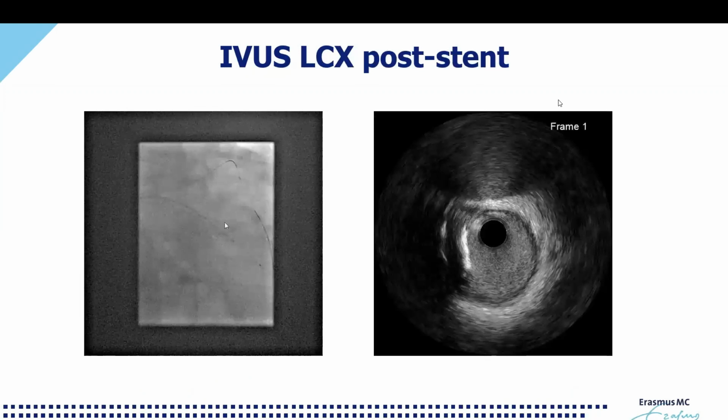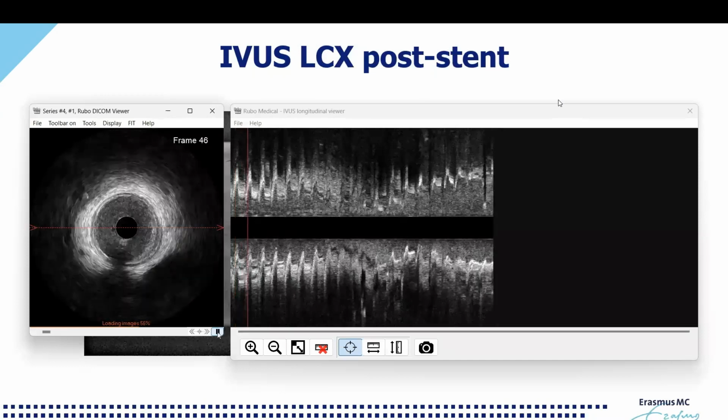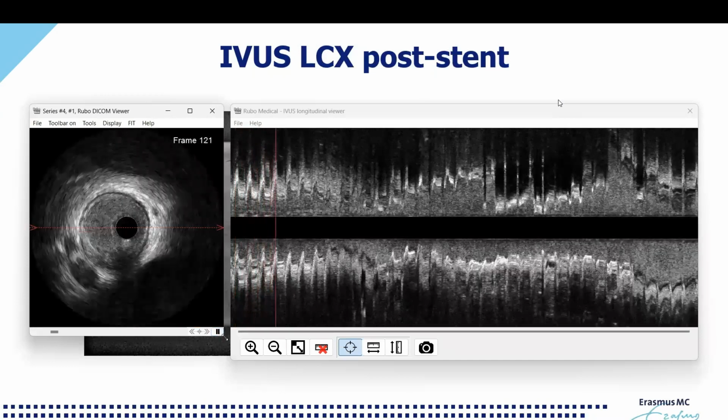Well, then of course the IVUS after the stent. Let's have a look. And you may think, you did a lot of pullbacks. That's not realistic.